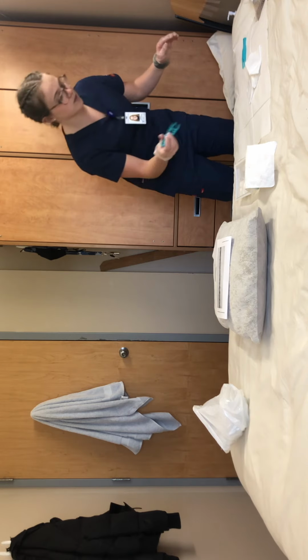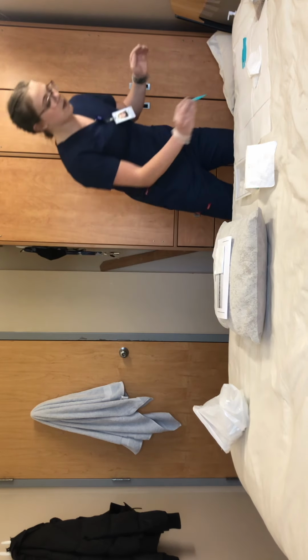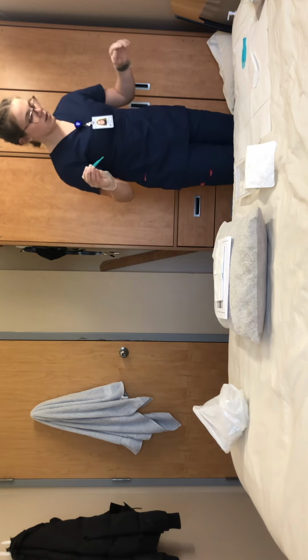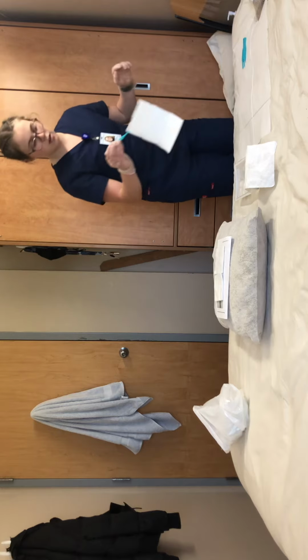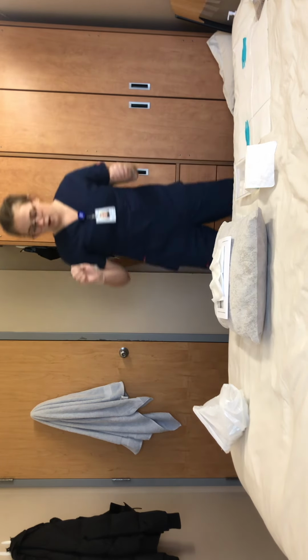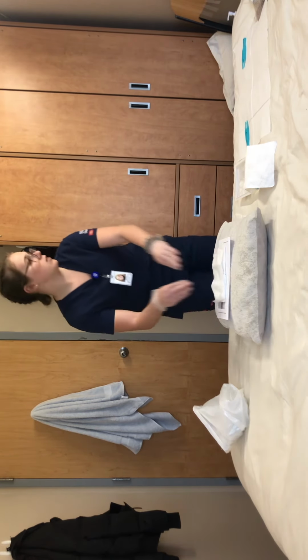So we'll be getting our tweezers and placing our 4x4s on top of the wound, making sure that we do not break sterile field. Normally, the 4x4s would cover the full wound, but just due to the size of mine, it will not completely cover. And then we will use my abdominal pad and place it over top. Because the top of the abdominal pad, the blue line, is not within sterile field, I'm allowed to touch the top of it to ensure that it is flat.